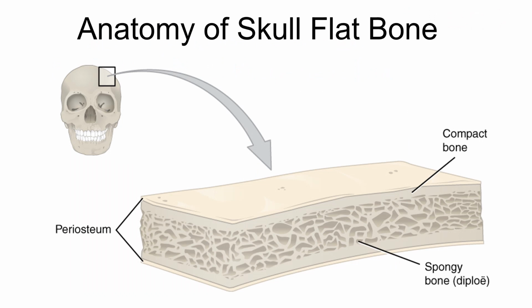In the structure of flat bone, the medullary layer is composed of trabecular bone and has an open-pore sponge-like structure. In the bone reconstruction of this structure, it is important to incorporate the bone marrow space layer into the sculpting, and promoting bone marrow invasion accelerates bone replacement. Bone graft without a spatial layer of bone marrow invasion is not actively remodeled into autologous bone, or it will take a long time to autogenously ossify.